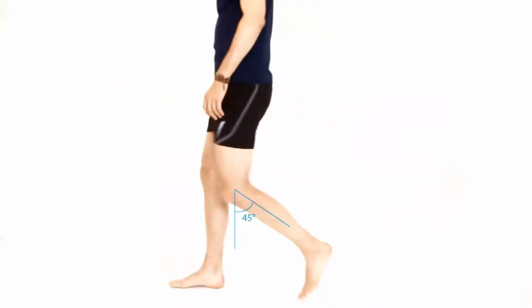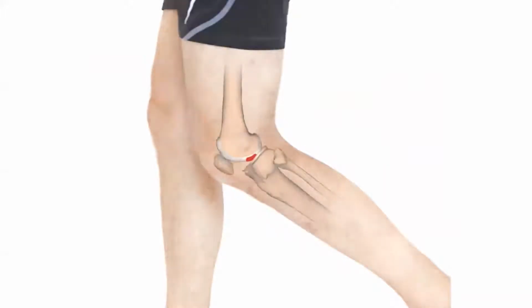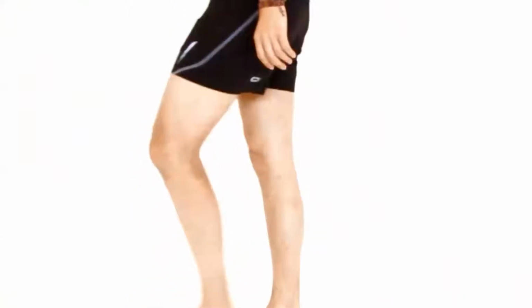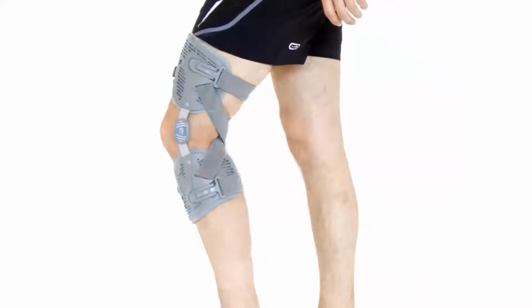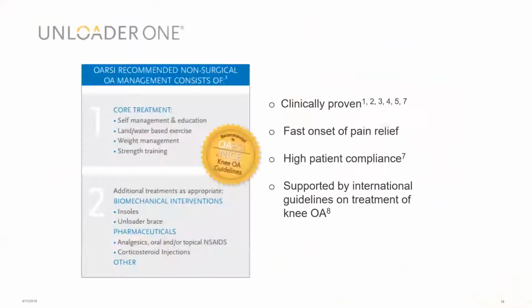I'm just going to show you a little video. So this patient has a cartilage-based lesion from about 45 degrees to full extension. So looking inside the knee, you can see that there's this area a little bit further back on the condyles. So it's important to apply that pressure earlier in the gait cycle. With an osteoarthritic knee, and we have a patient here with osteoarthritis, from 25 degrees to full extension, we're wanting to apply that unloading. So you can see when we look inside the knee, that area of wear is more towards the front surface, more where we associate it with full extension, so the last 20 degrees. So you can see we use these dependent on where the lesion is located. With cartilage lesions, they're often sustained in increasing flexion as opposed to the area affected in osteoarthritis.